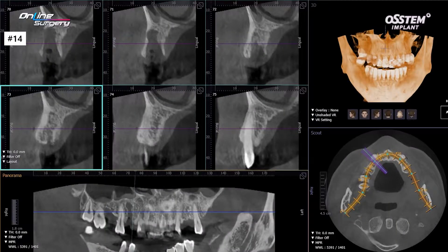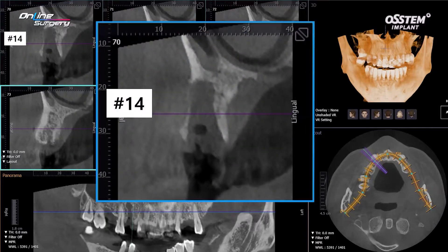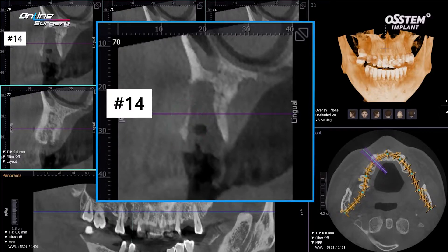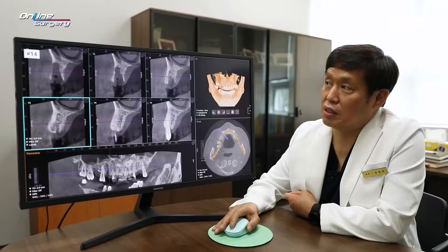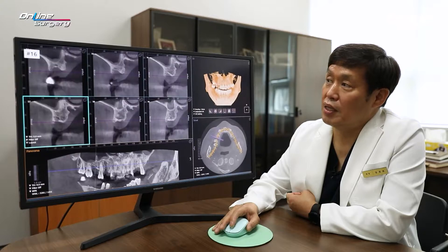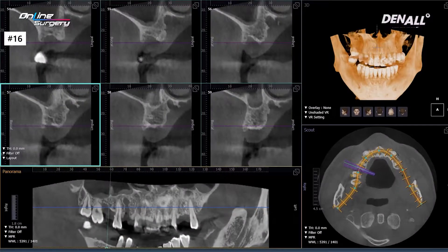On CT, looking at No. 14 on the apex side, there is a slight amount of bone on the superior side, but below that there is no bone. Therefore, after implant placement, I anticipated the need for bone augmentation, especially bovine bone. Looking at No. 16, it's acceptable in the main area, but on the distal side there is a lot of alveolar bone destruction.